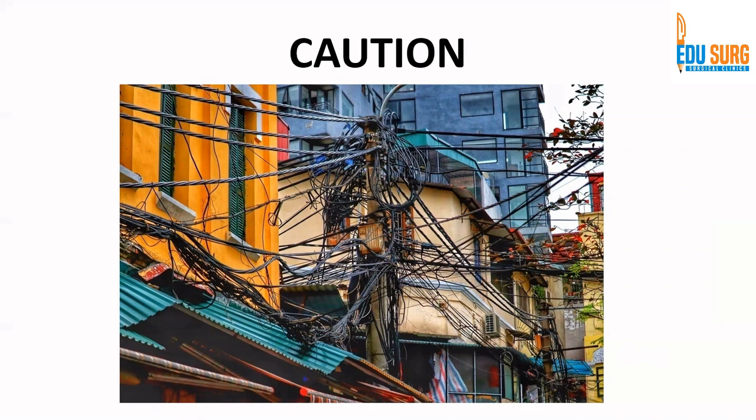But you have to understand that all the wires have to be placed very meticulously so that when you need those devices, you don't struggle. And that can reduce your anxiety in the OT, that can reduce temper related issues in the OT if you get all your devices properly.